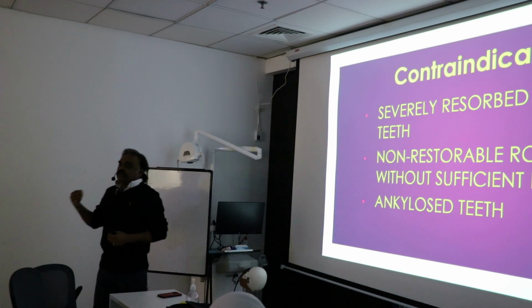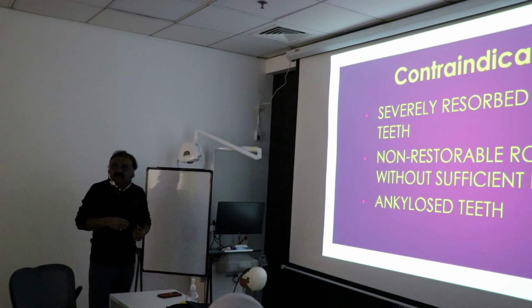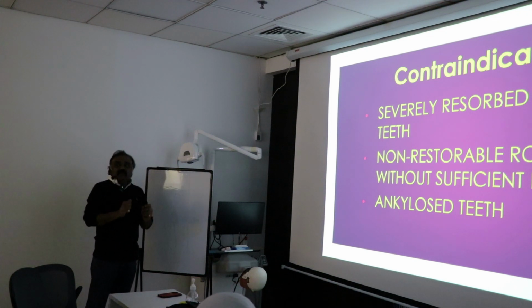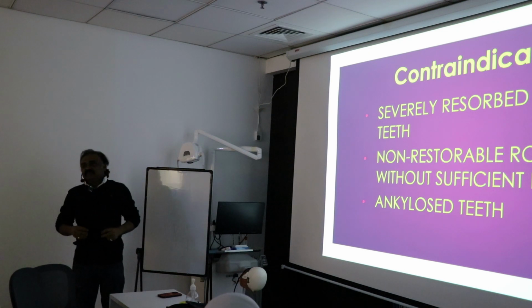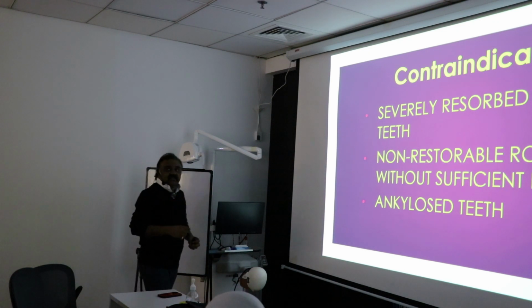Should I think in terms of a non-invasive procedure like an orthodontic extrusion to make sure that I am able to improve the implant site? The question comes is, how do I clinically make the decision? What should be the amount of mobility that I should look for?